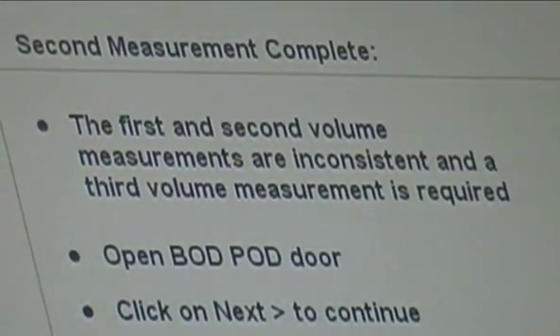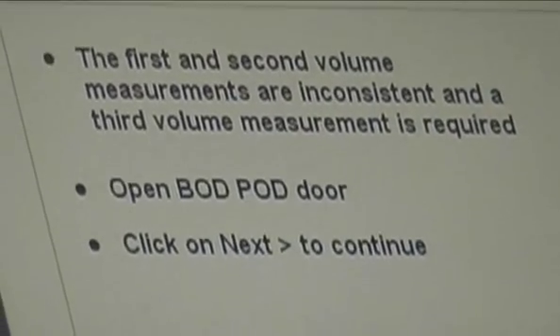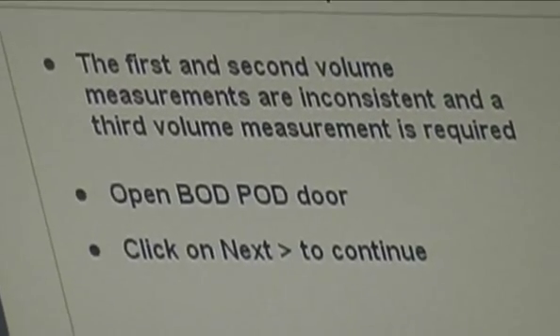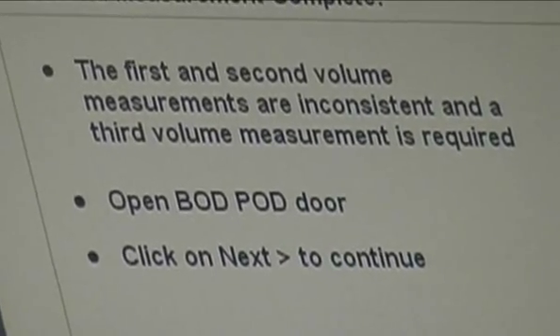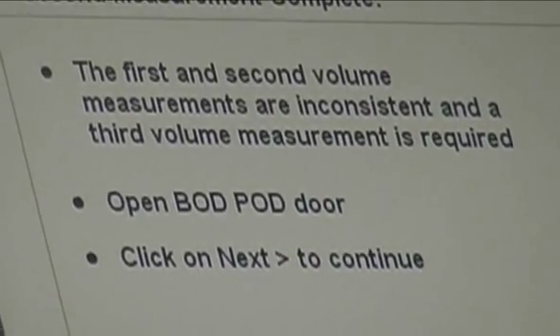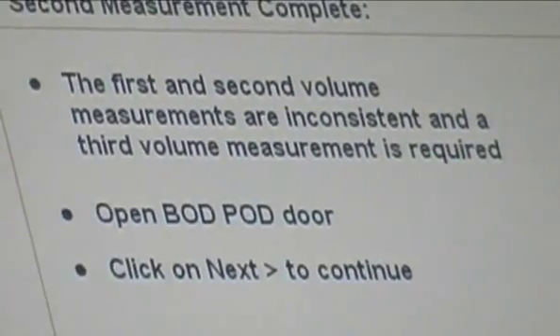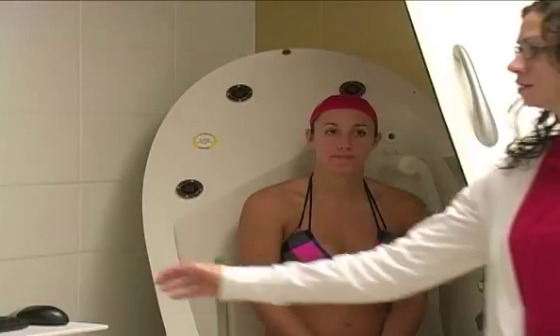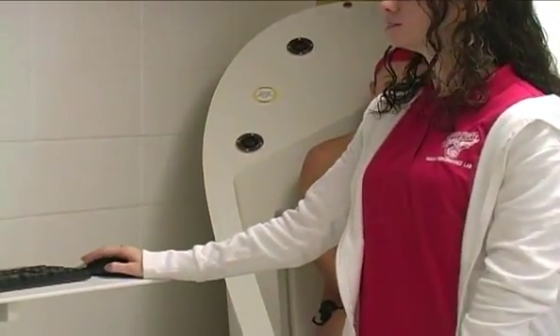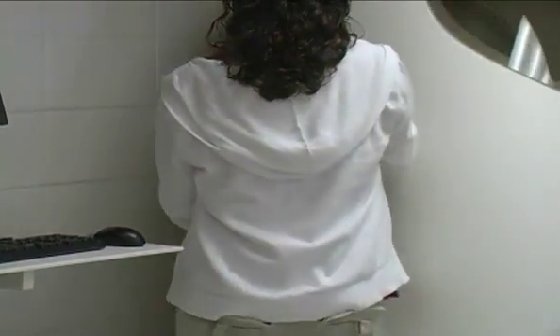So as I mentioned, if your first two volume measurements aren't within 0.2%, then it will prompt you for a third measurement. Typically, there was some movement, or sometimes people are chewing gum in there, something. In any event, they're very tight specs. So this happened. It said first and second volume measurements inconsistent. A third volume measurement is required. It's our specification. So we need to do a third one. Okay, one more 50 seconds.